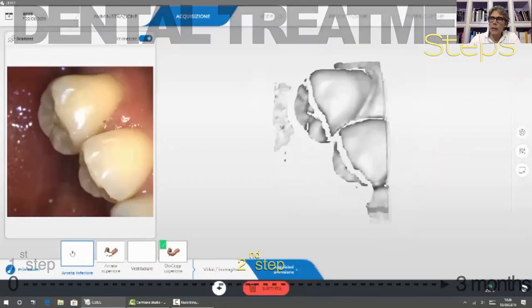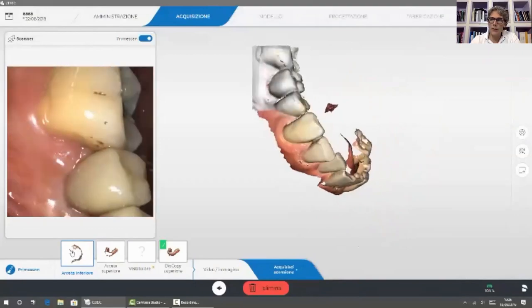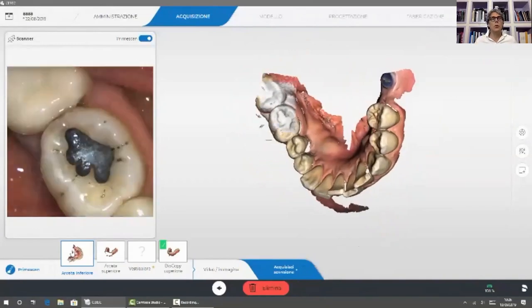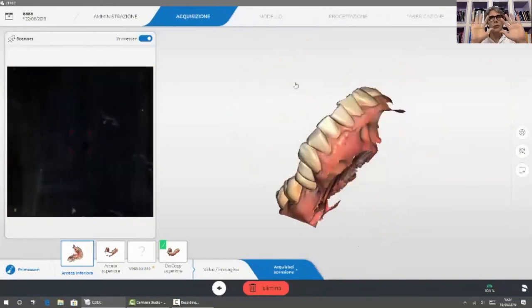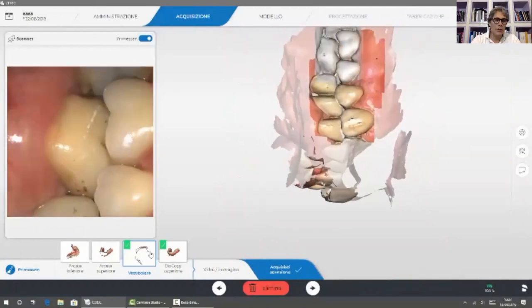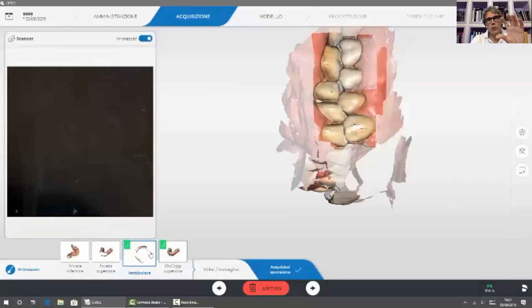In the subsequent step, I took the third impression that involves the antagonist, and also for the antagonist, in order to rebuild the palatal surfaces of the anterior upper dental arch that will take part in the incisor and canine guides, it's very, very important to carefully take a good impression. The last impression involves the bites of both sides of the patient's mouth. I invited the patient to clench in a proper position, and thanks to this impression, I share with the software a proper position of both dental arches.